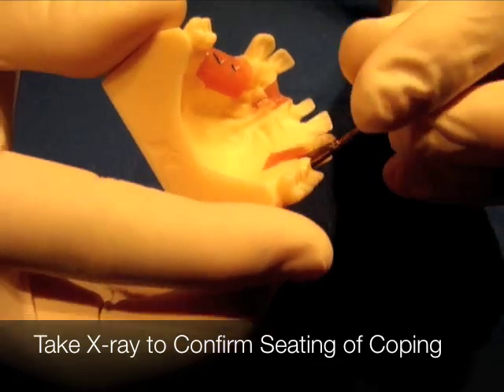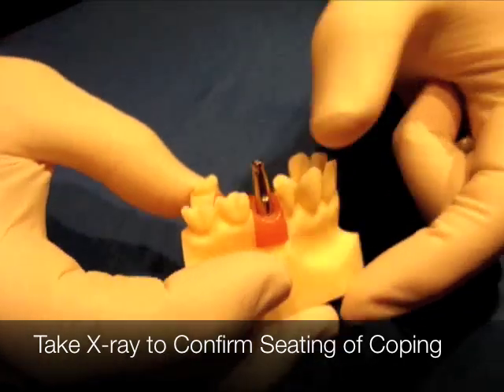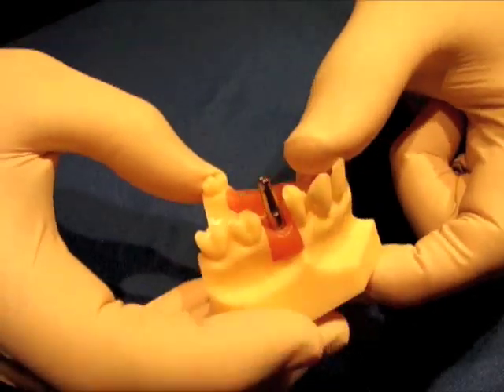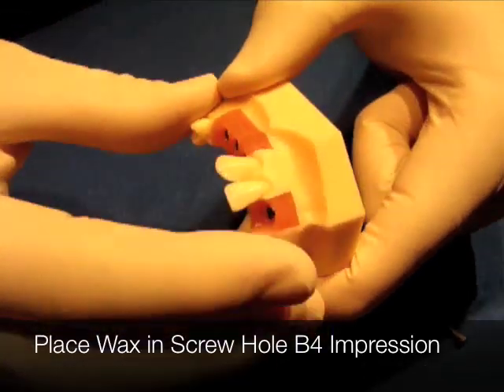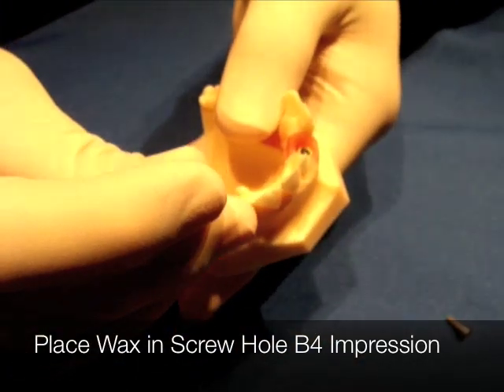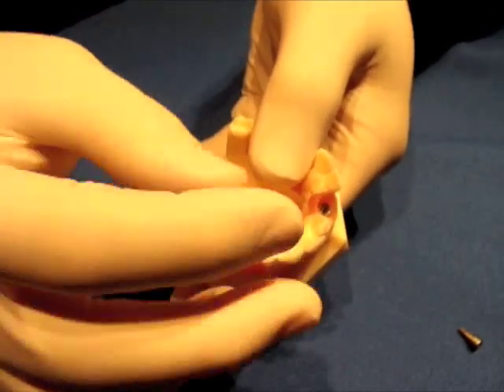Then you're going to take an x-ray. This is just finger-tightened down — you take an x-ray and that's going to be to take your impression. So you take an impression tray and go over top of this. Then you remove this and send the patient back out with their healing button.